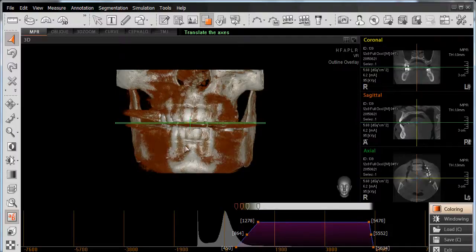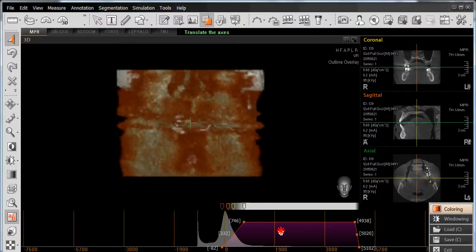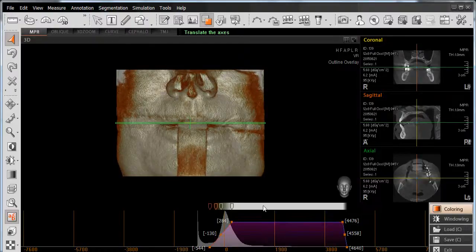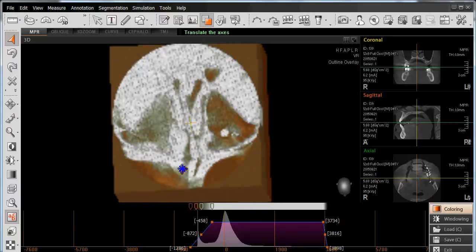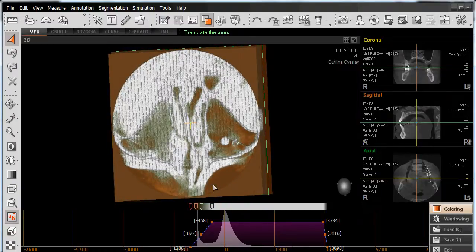If I wish to change this density range, the simplest way is to position the mouse on top of the purple area, left-click, and then slide the mouse to the left. You'll note that I've added more soft tissue to my view. I've set the value to negative 544, which is less than the density of skin or soft tissue, but not down to the equivalency of air. As I left-click and go further, I'm getting to the point where I've gone beyond the density of air — and if I right-click, you'll see this is my data itself.